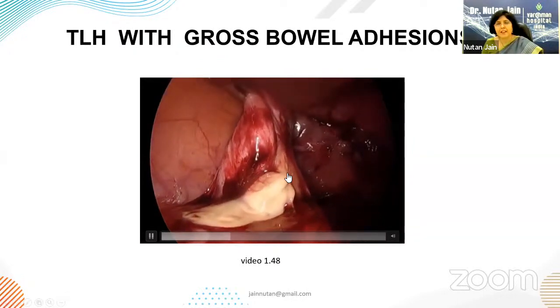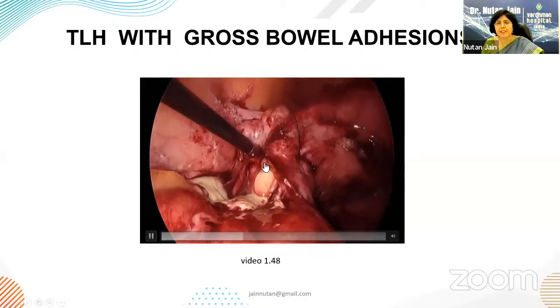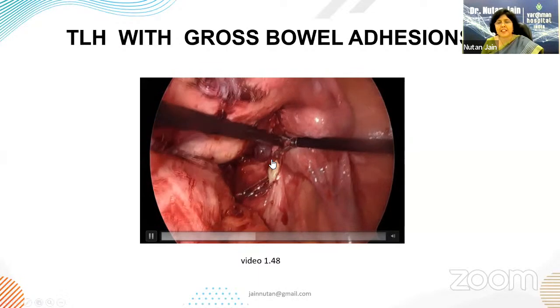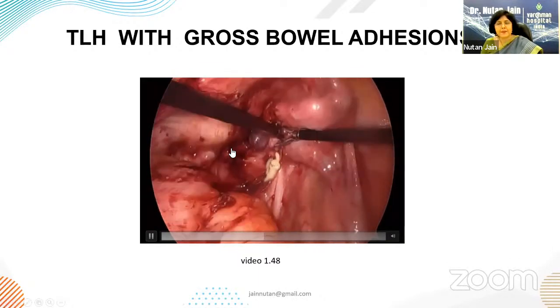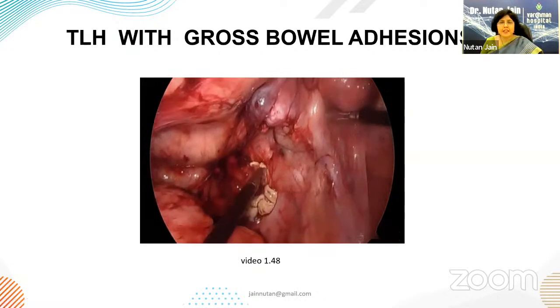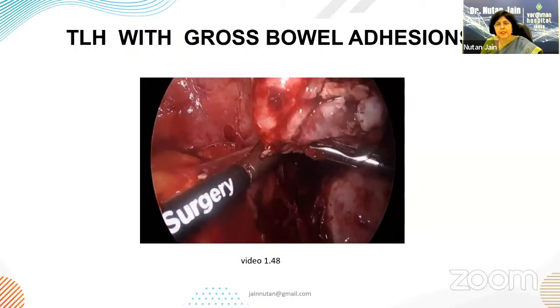This patient, I remember this is a video from when demonetization was announced. She was an investment banker, and she said, I got late because of the demonetization and I had to deal with my clients. And she got so late that she was rather not well. So this was a diagnostic dilemma rather than endometriomas. She had TO masses, and here the bowel adhesions were taken care of, and we proceeded with the TLH.